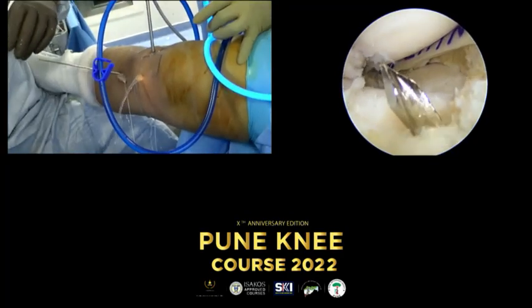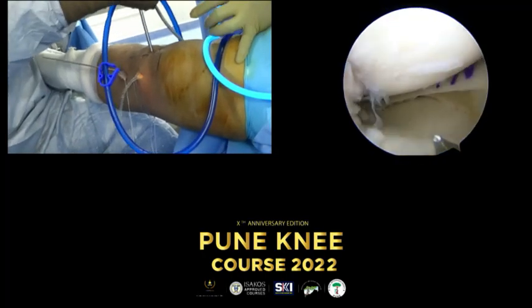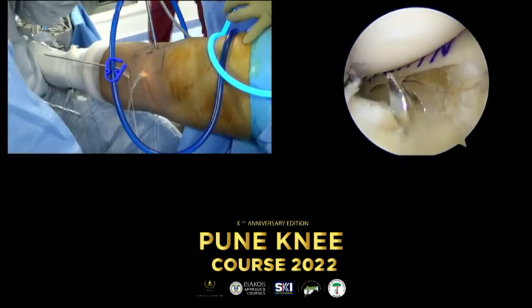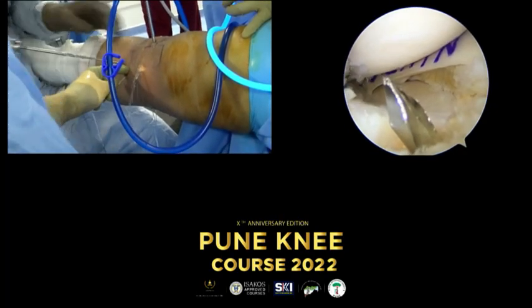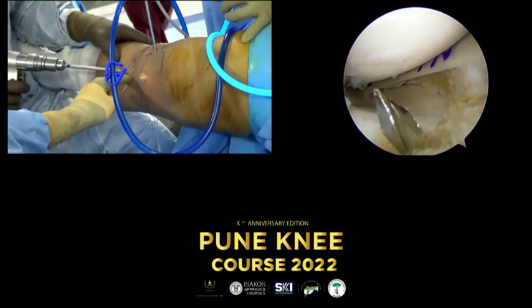And if you're going to be using soft tissue fixation, like what Pablo is doing, make sure you order a slightly oversized graft, because you want to get some meniscus tissue inside the tunnel, which is just demonstrated.